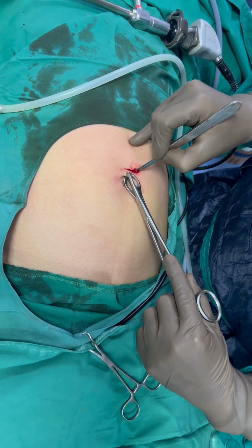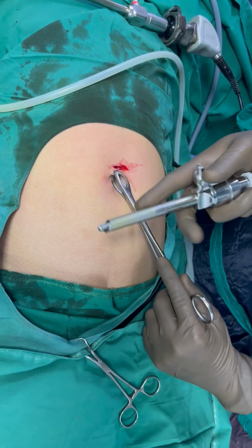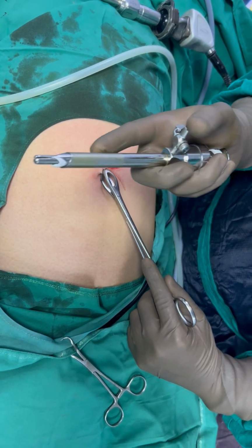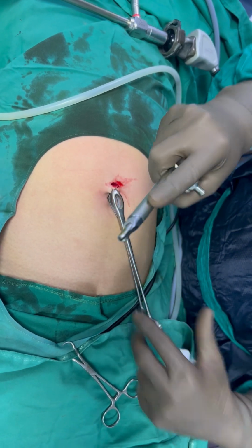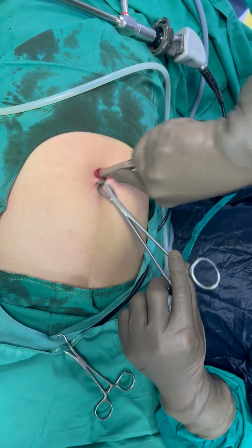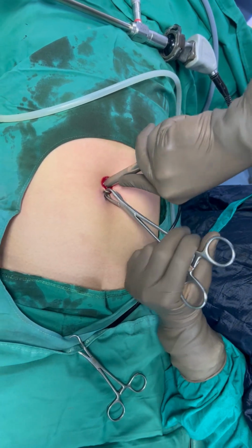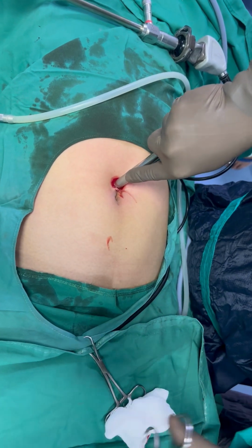We will insert a safety trocar. We have to hold the trocar like this in your hand, in the palm. Okay, place it on the palm, just hold it. This finger acts as a safety finger, which protects the abdominal organs from injury.